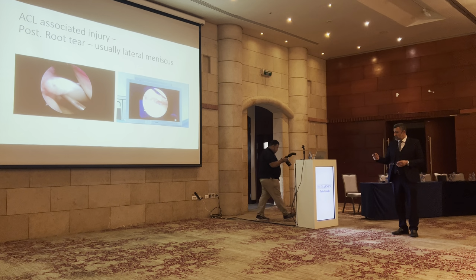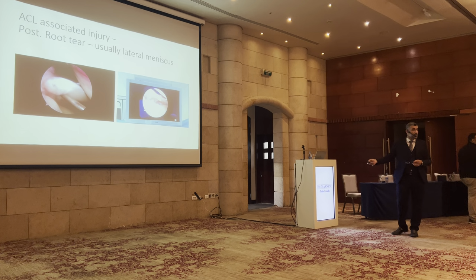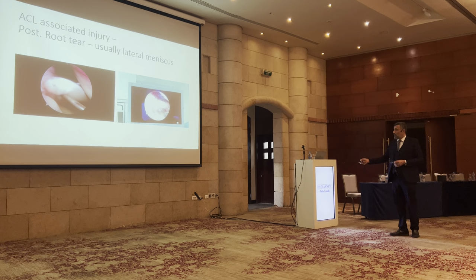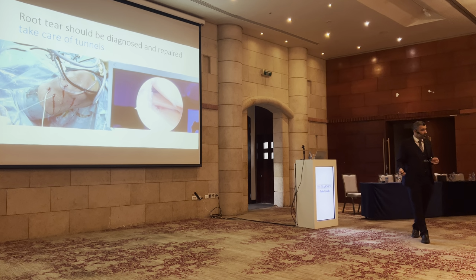Now this is another associated injury you see here, posterior root, and we see it more commonly than before because we look for it. This is posterior root, and again we should repair it. We use the same techniques as root repair, but here this is important because you have two tunnels, the ACL tunnel and the root tunnel.